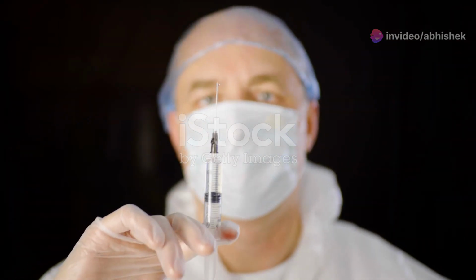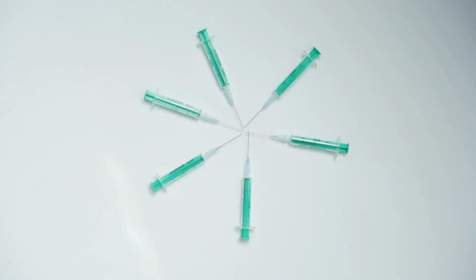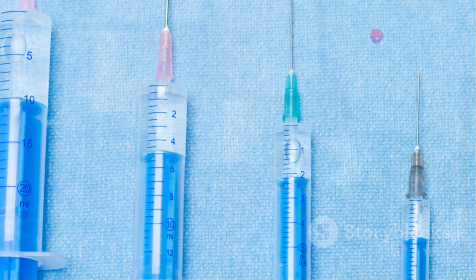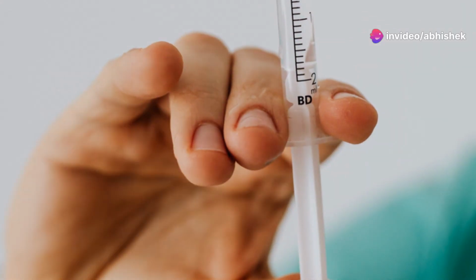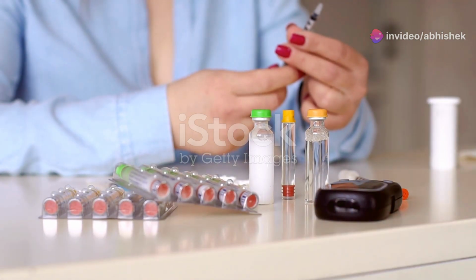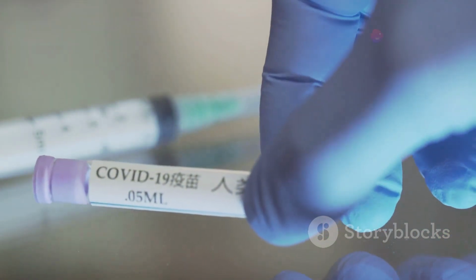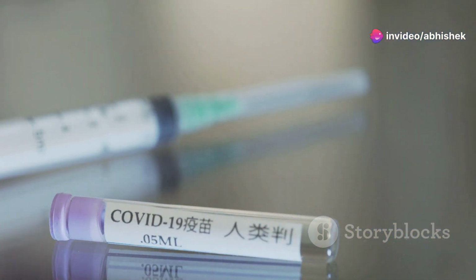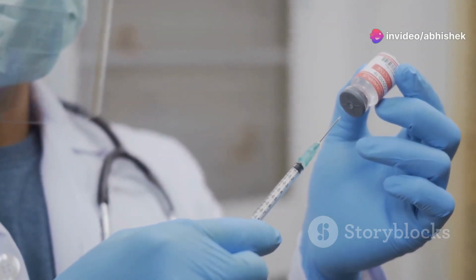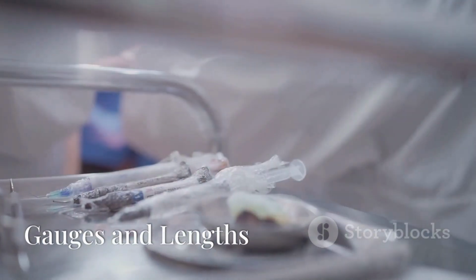Syringes are essential tools for injections. They consist of a barrel, plunger, and needle. Different types of syringes are available. Hypodermic syringes are the most common type and are available in various sizes. Insulin syringes are specifically designed for insulin administration and have smaller capacities and finer needles. Tuberculin syringes are used for intradermal injections such as TB skin tests and have a small capacity and a fine needle. The choice of syringe depends on the type of injection, medication dosage, and patient factors.